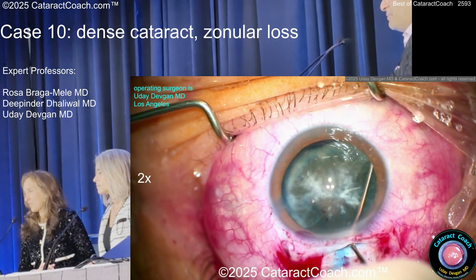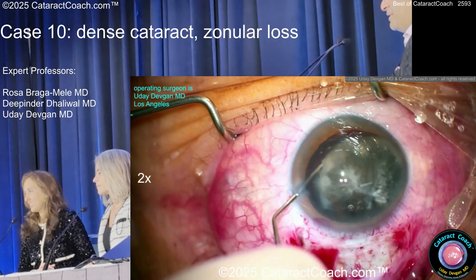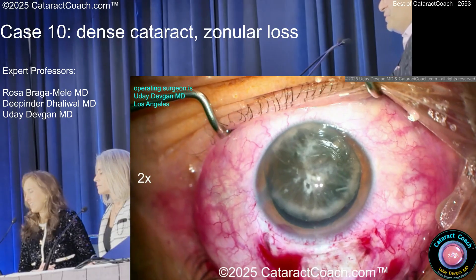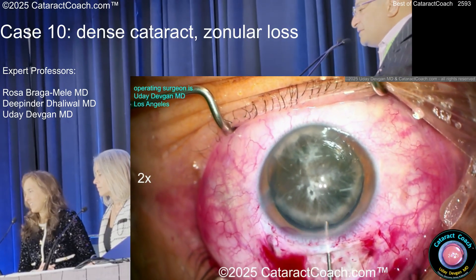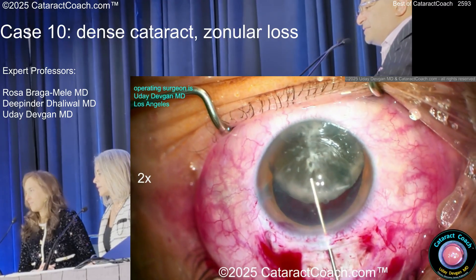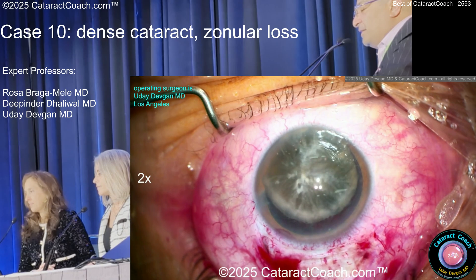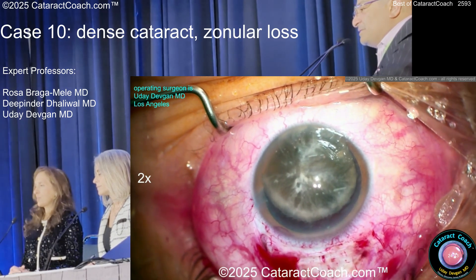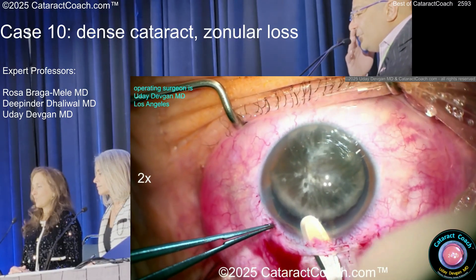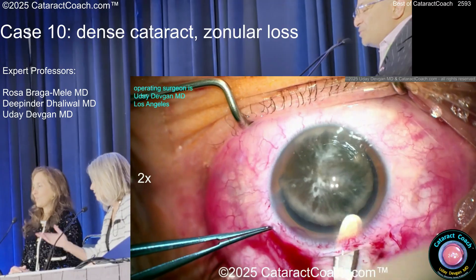I want this nucleus out of the eye — I don't want it to go south or end up on the macula. Here's the big nucleus. There's no cortex left in this eye. I'll put viscoelastic behind it and dispersive in front of it to protect the cornea. Now here's my cheat code: an opposite paracentesis. First, enlarge the incision — let me just make it bigger than I think I need.